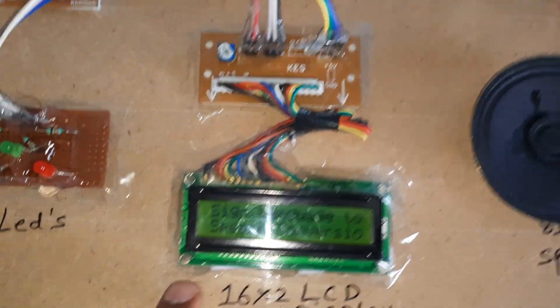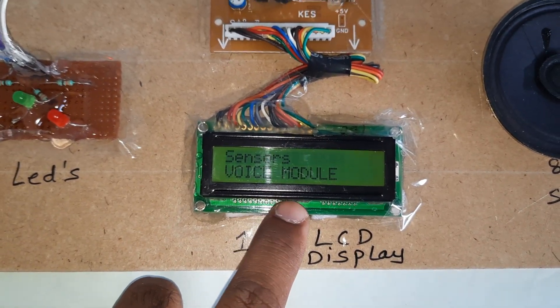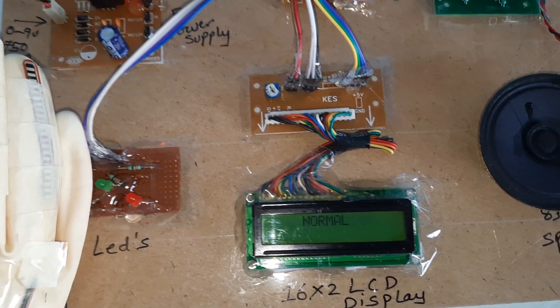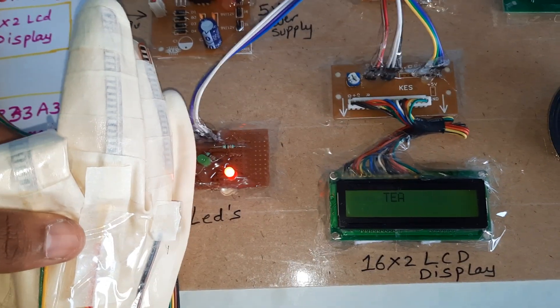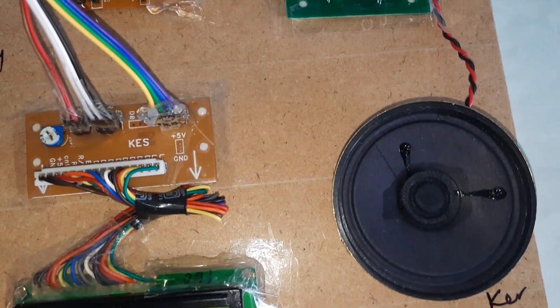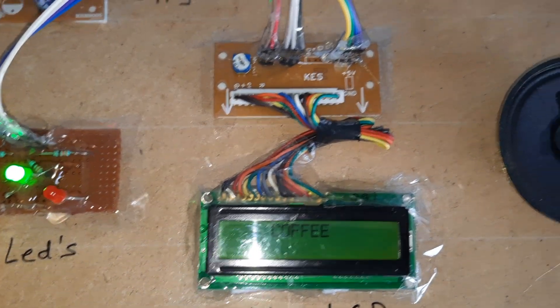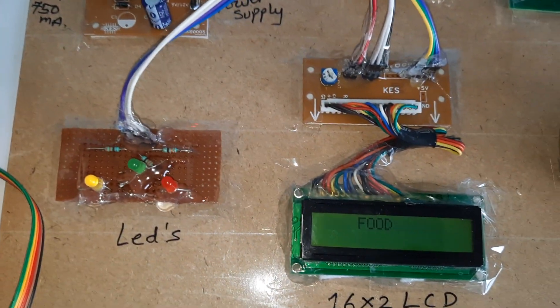Now starting the power supply. Sign language to speech conversion using Raspberry Pi Pico with flex sensors. The flex sensor output reads normal. Demonstrating a gesture — bending fingers for 'coffee.'